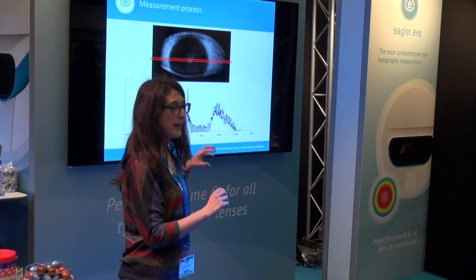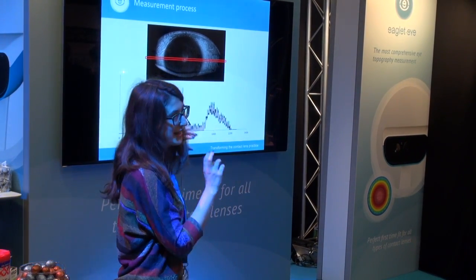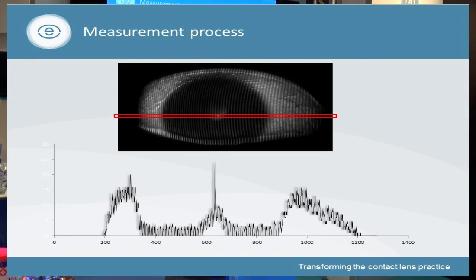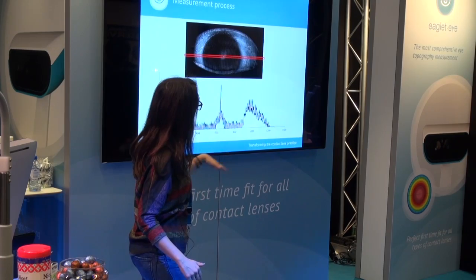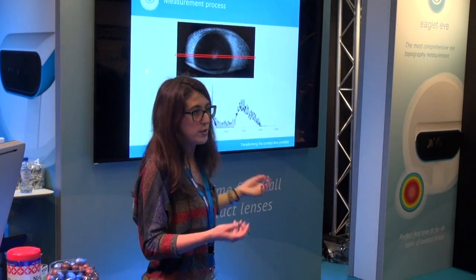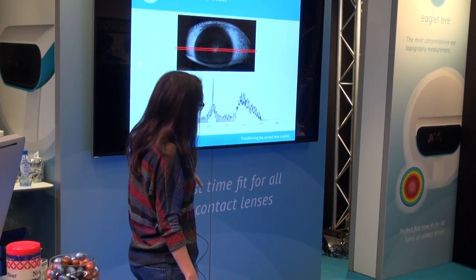Now we are going to analyze one channel before the merge. We have this kind of pattern in the eye, so imagine that we select only one row, and we have something like this. This is the information in the space domain from the projected pattern. The grids that you see here are these grids here. But as you can see, we have nothing there. It's really difficult to extract information from something like this. So that's why we need to change to the frequency domain.